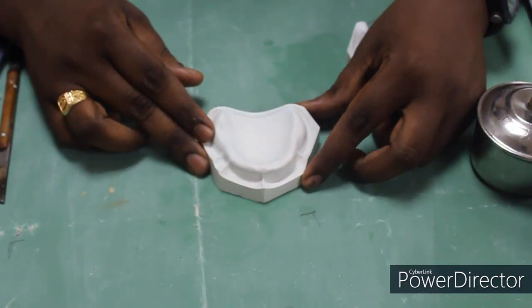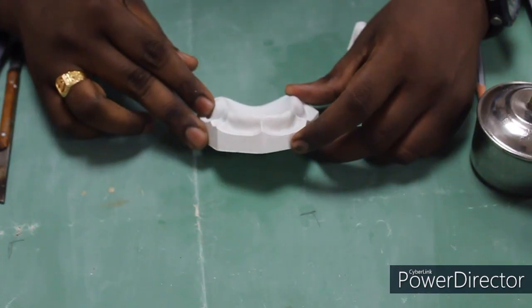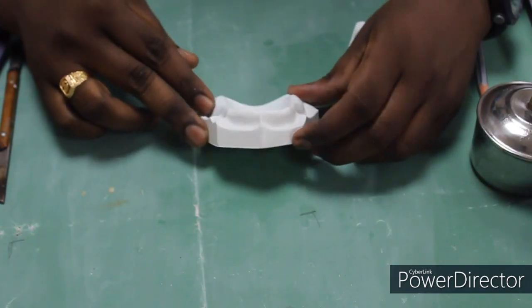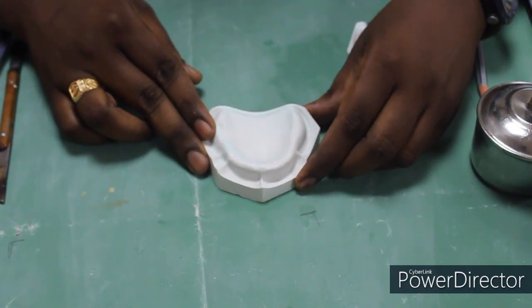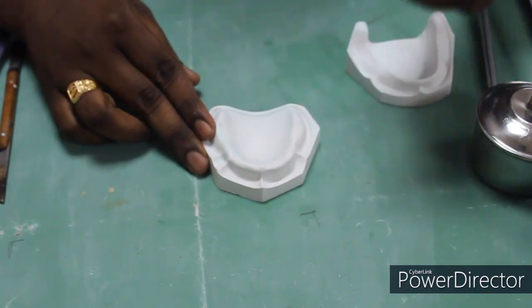Welcome to knowledge demo. So today I am going to explain about the special tray fabrication for maxillary and mandibular complete denture.